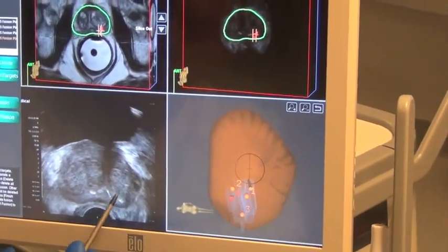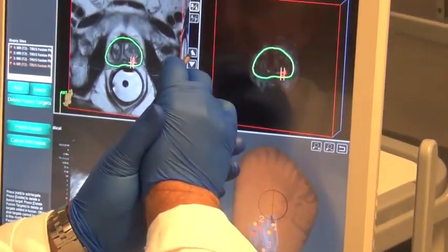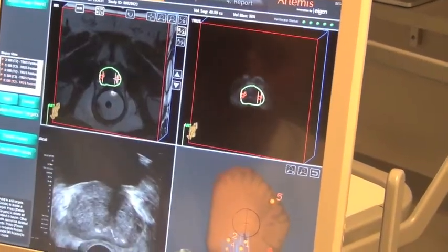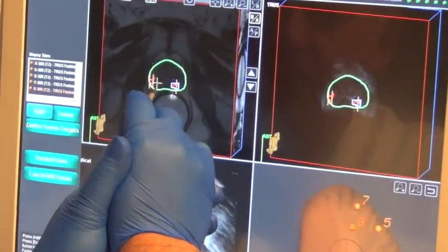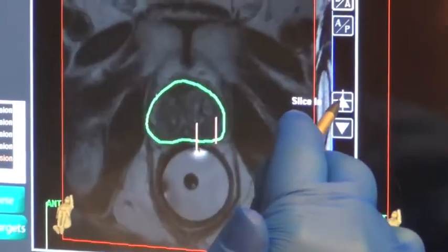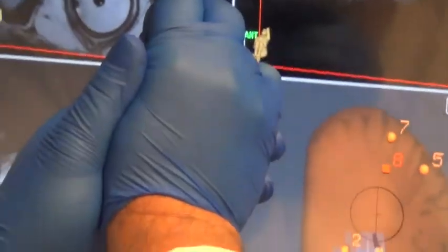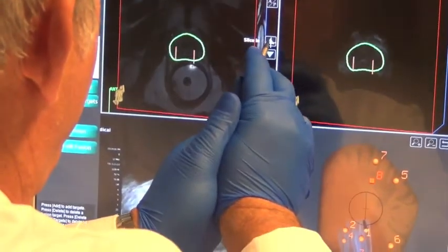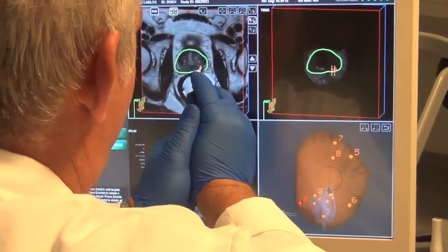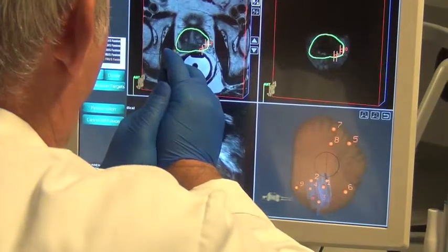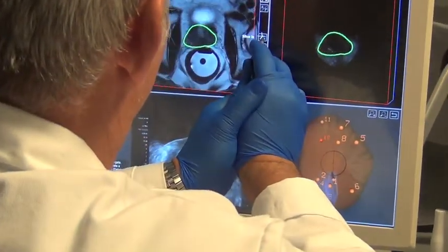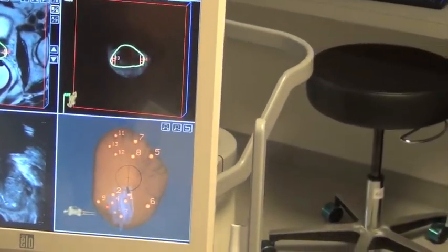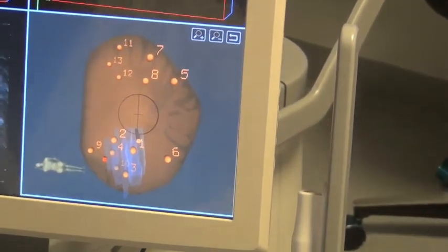That's a very nice demonstration of being able to target the MRI abnormality. I'll note that that area, if you look at the ultrasound, is quite normal in ultrasound — we see no abnormalities in those regions. So that's important. We're well sampled in the left mid-region, but certainly in the left base we want to get that area studied as well. We've got a biopsy pattern built in here — we may not use all these samples, but this allows us to get some good sampling through the region that's most suspicious.